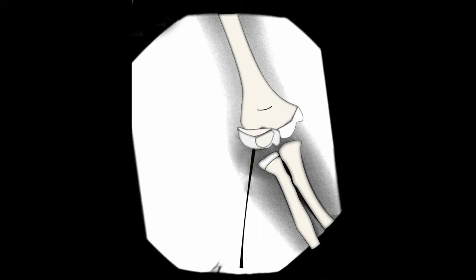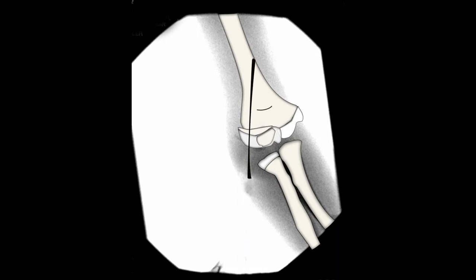The cannulated guide pin is driven up the lateral column of the distal humerus and through the opposite cortex.